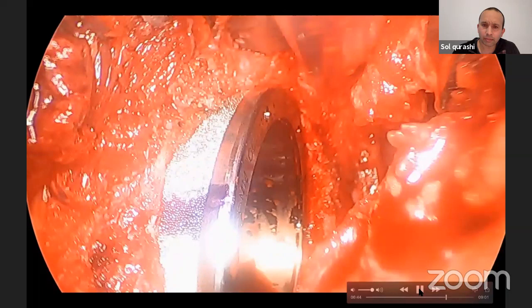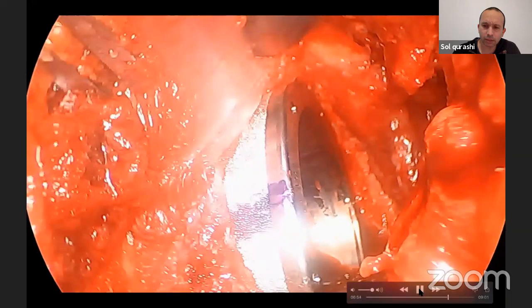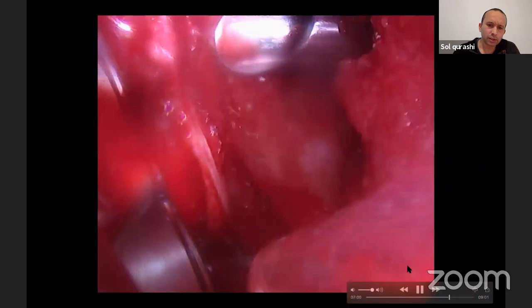And if you look inferiorly, hopefully this video will show a bit of inferior stuff. It's actually playing off a hard drive, so it might speed up sometimes and slow down sometimes. I apologize for that. It's quite a bit, 9 gigabytes, this video. There's the TAL. So we can see that the cup is parallel to the TAL.